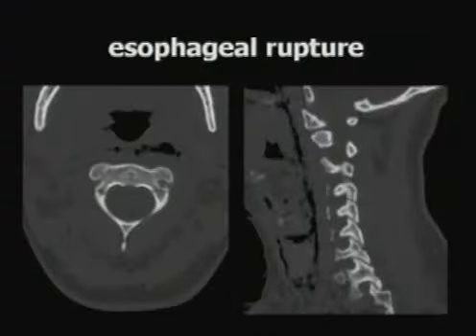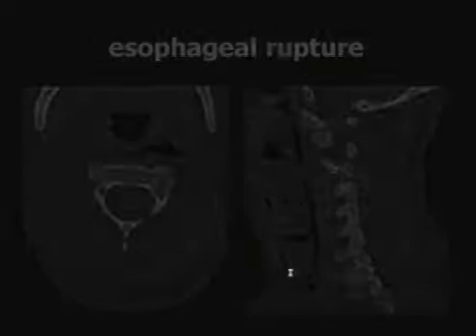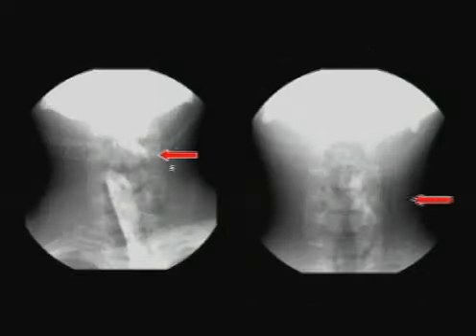This was a 9-month pregnant lady sitting in the back of a cab on 42nd Street in the springtime this year when the cab decided to play pinball with a bunch of other cars on the street. And she suffered a blunt esophageal injury. Also, if you can tell, there is a subtle undisplaced hangman's fracture here, a very uncommon combination. But we have air in the wrong place, tracking up in the prevertebral soft tissues. Went on ultimately for the esophagram, which showed the leak and confirmed the esophageal injury.